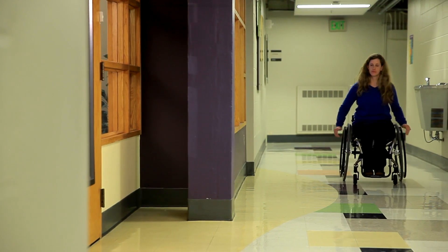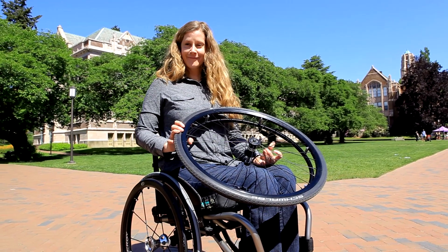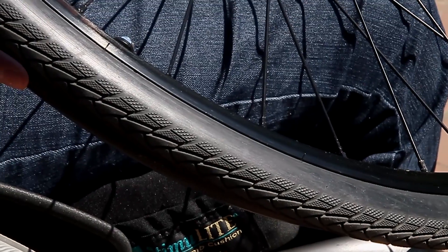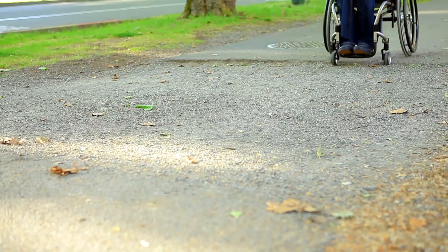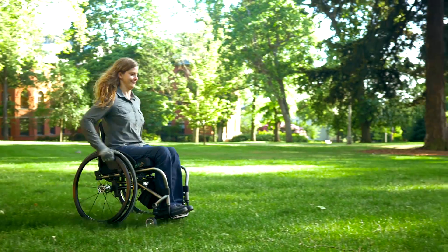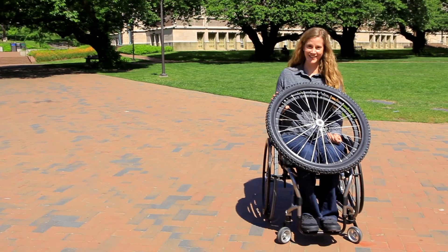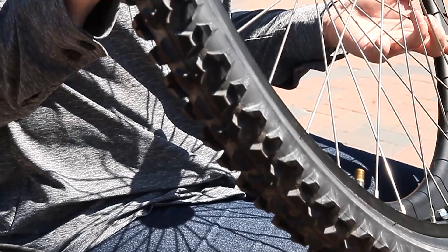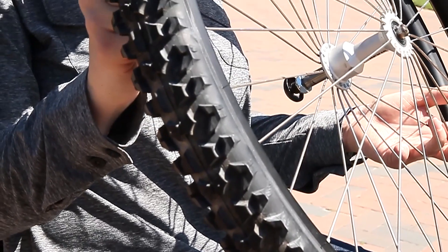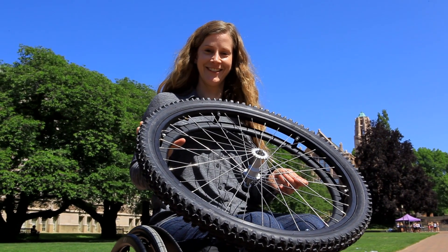If you tend to push on hard smooth surfaces like tile floors most of the time, you will have an easier time pushing a high pressure, low tread tire. In contrast, if you typically push over gravel and grass, you may want low pressure tires with thick tread. However, thick tread tires are typically too hard to push for everyday use on indoor surfaces or sidewalks and should be reserved for specific activities.